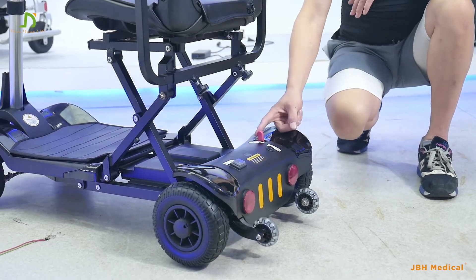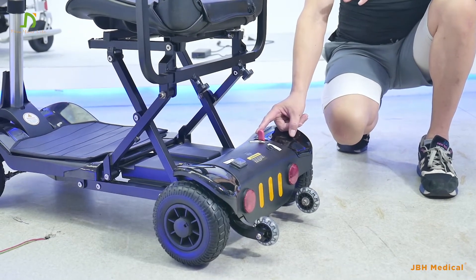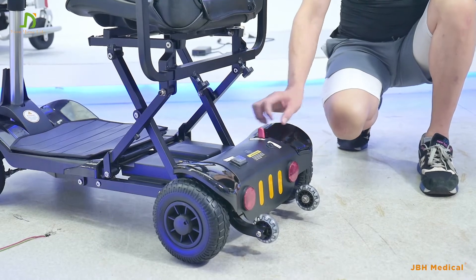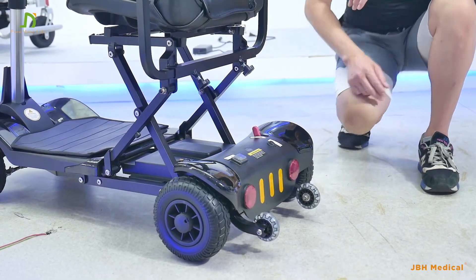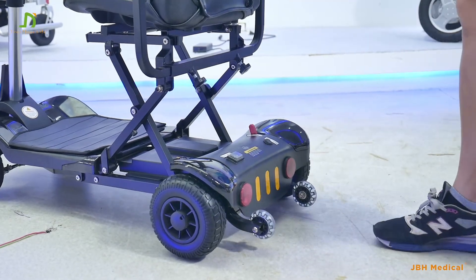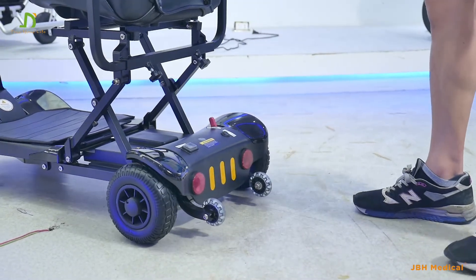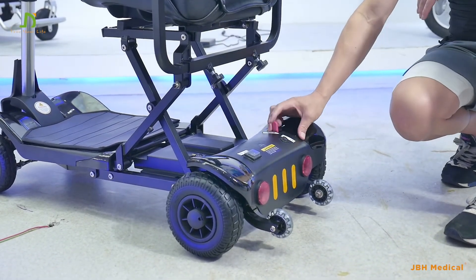Right now the blocking lever is on the automatic function. When you have this on, you cannot push the scooter forward manually. So if you want to push the scooter forward, turn it to this position and use your hand to push — it will go forward and backwards. If you want automatic driving, turn it back.